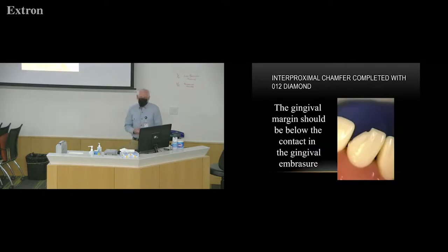that's what the preparation looks like. Can you see how the composite's going to grab onto that tooth and it's going to stay there and it's going to be long lasting? But this last cut, we want to make sure it's slightly below the contact so that we can get in there and restore it.